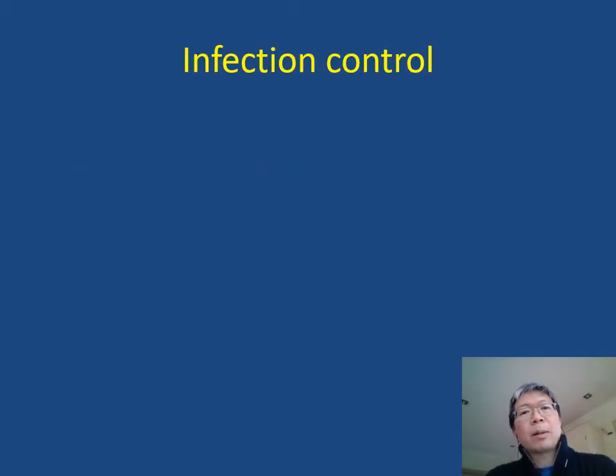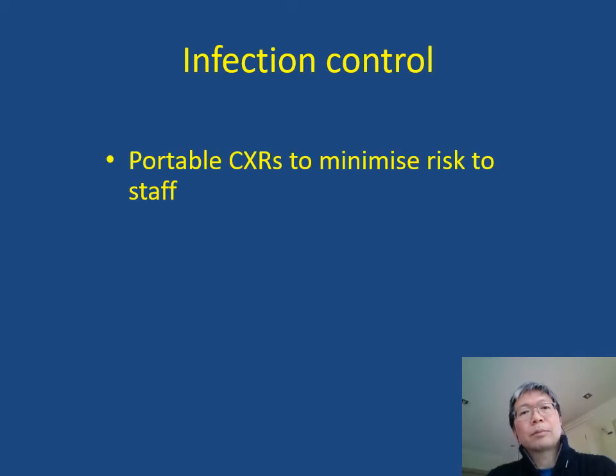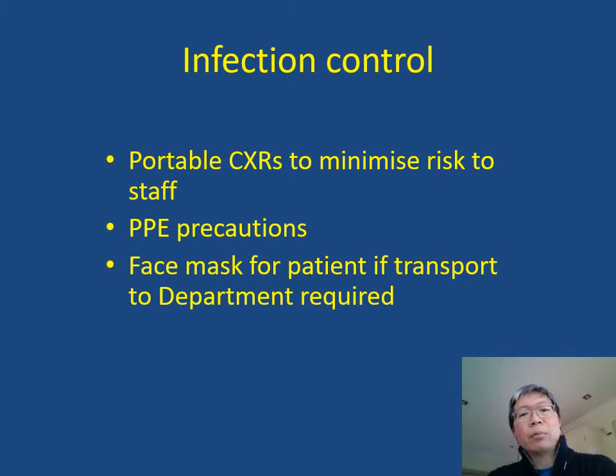Firstly, some words about infection control. Most of you will have seen that our X-rays are now done by portable machines to minimize infection risks to staff. At all times, proper PPE precautions should be taken in tending to patients with COVID-19 infection. Where films or imaging from the department are required, patients are required to, as a minimum, wear a face mask during the transit.